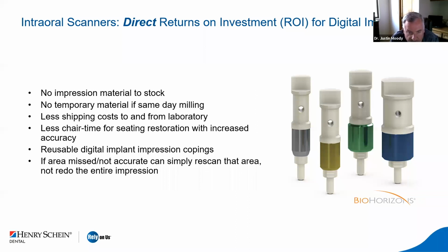I do believe that intraoral scanning is more accurate than impression materials, especially in the realm of being able to get that perfect impression. And it kind of goes down to that bottom. If we missed an area, if we don't like the accuracy in that area, we can simply delete it and start over. We don't have to wait for the impression material to set up. And after a couple times waiting for the impression material to set up, human nature takes over, and we're just like, hey, you know what? That's the best we can do. We'll just send it to the lab, and we'll have that done. So I think it's really going to cut down on our remakes as well.